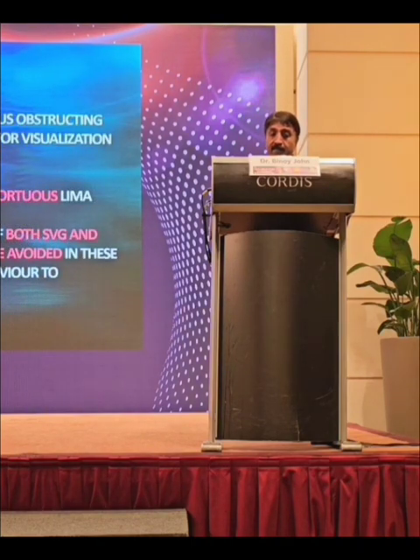Coming to IMA angioplasty, the IMA is prone to dissections and spasms. They are tortuous and prone to pseudo lesions, and kinking is a major issue to be remembered in a tortuous LIMA. In spite of all these confounders, safe completion of both SVG and LIMA interventions is possible, and a repeat CABG can be avoided in high-risk cases with a sound knowledge of graft behavior and interventions. Thank you.